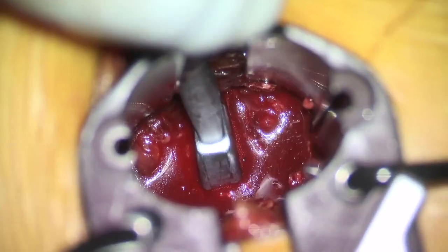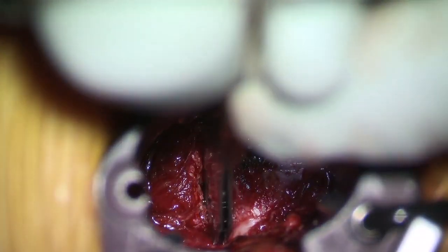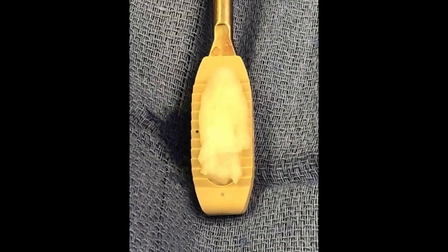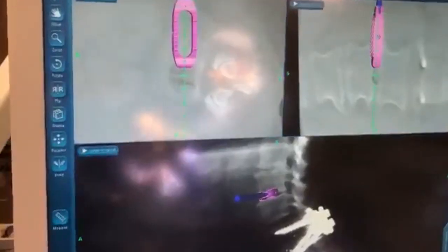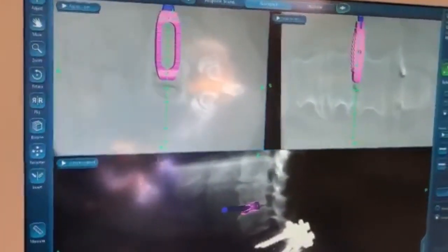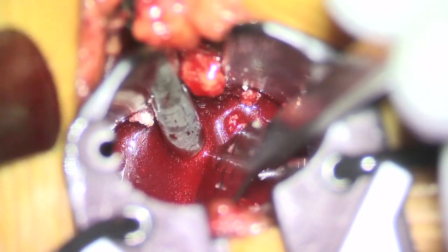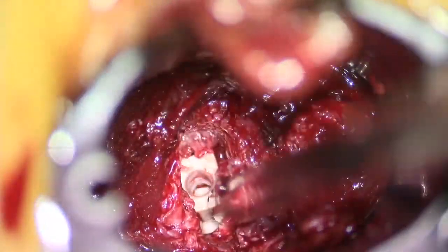Repeat the same with curettes and cobs and remove whatever material is there. This is the trial going in, as you can see on the navigation screen and directly into the wound. After the disc space is prepared, put the slider inserters to protect the end plates. The cage is loaded with BMP and then passed in. Once you are at the midline of the vertebral body, perform the orthogonal maneuver — navigation gives you an idea of exactly where you are.